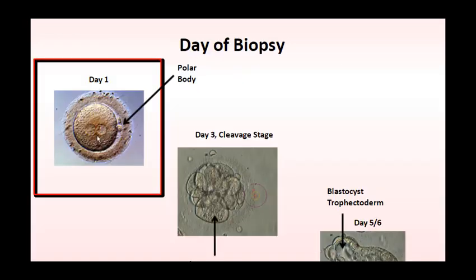On what day should biopsy be performed? Each day has its pros and cons. During the course of an IVF cycle, biopsy may be conducted at one of 3 stages: polar body, day 0 and day 1; cleavage, day 3; or blastocyst, day 5 and day 6.